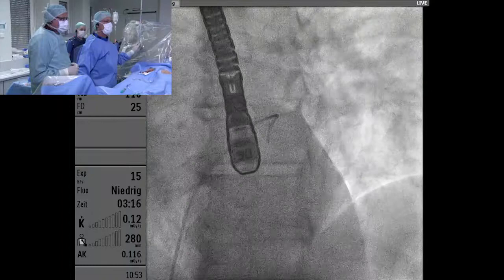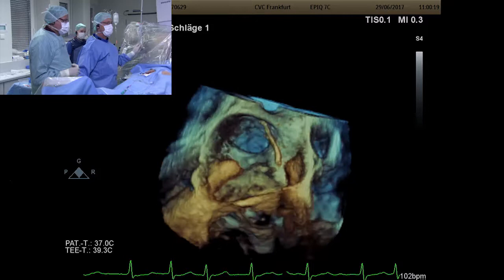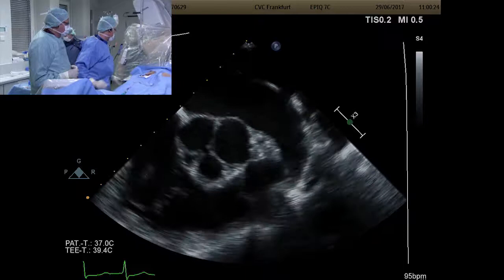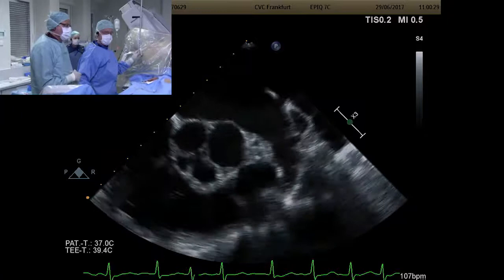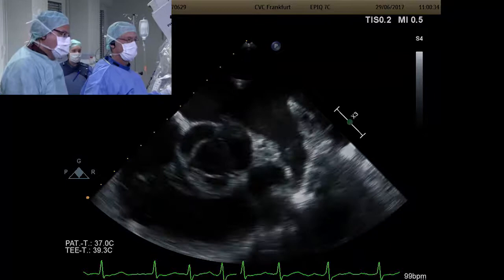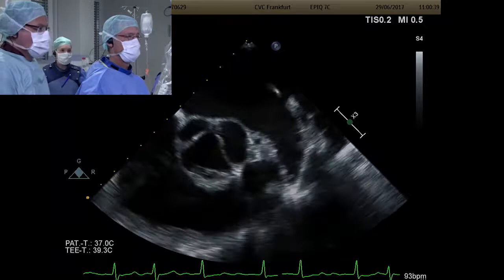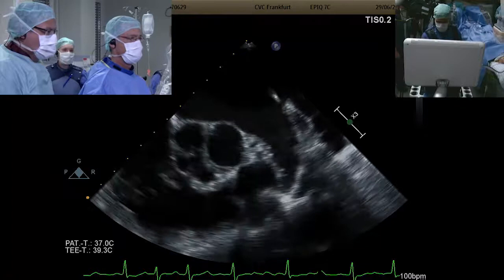Looking at the echo, comments are requested from the audience regarding device selection and device size. At 0 and 135 degrees, the landing zone is around 29 to 31 mm. At 45 and 90 degrees, the landing zone was around 26 mm. The depth is more than enough — around 25 mm at least.